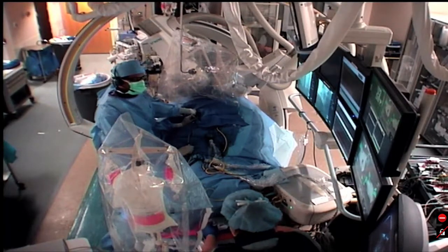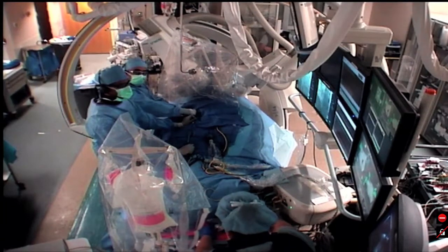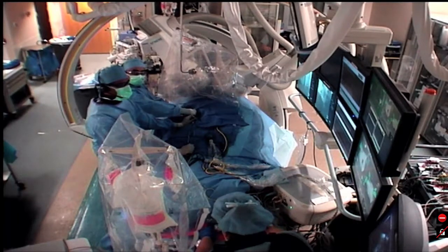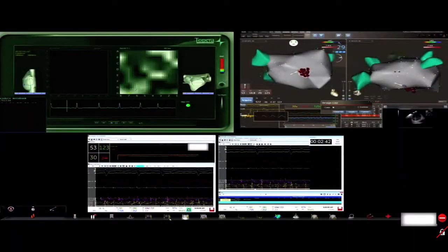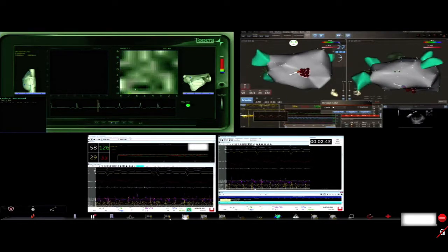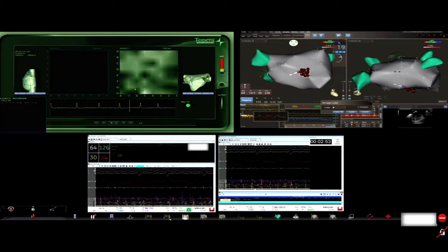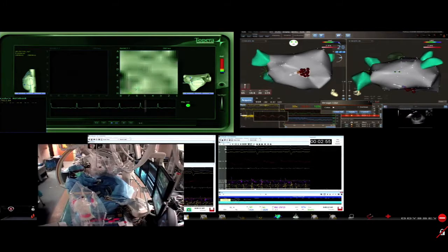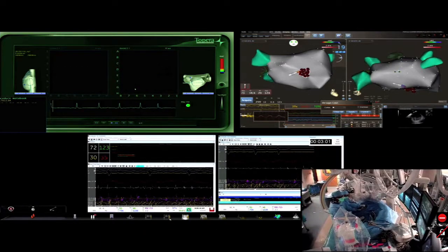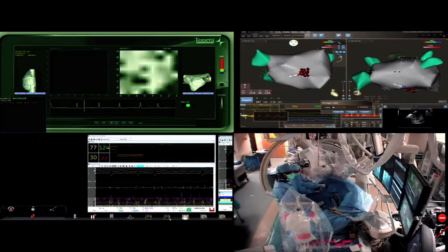What I can perhaps emphasize, and I was about to ask the question to David, in fact, is that the endpoint in our lab is definitely not to get the disappearance of all signal in this region, because this, with an ablation catheter, is quite difficult to achieve and means that you have a really large lesion so that you kill all the far-field activity that may pollute your signal. So we're not looking for that, but rather for a slowing of the local activity and also for the loss of the sharpest components. But that would be it.